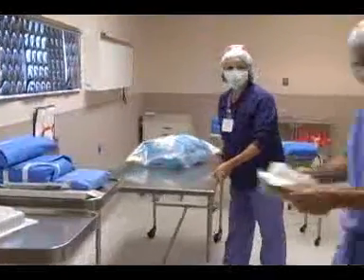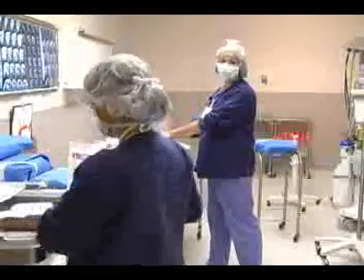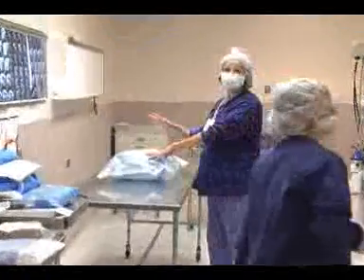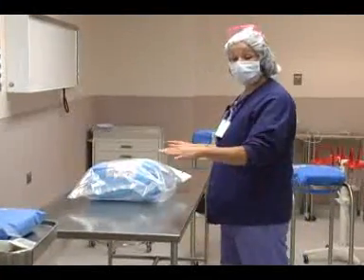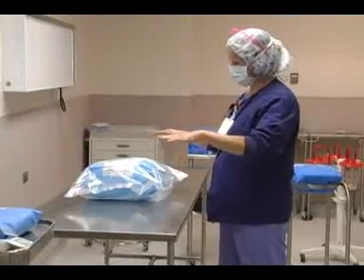This is our table that the surgeons and the surgical team will be working off of. We're going to open a sterile pack that has all of our basic items that we will need during the surgery. These are custom packs, customized for each procedure. Anything below the level of the table is considered not sterile, so anything that we're going to be using will have to be on top of this table.